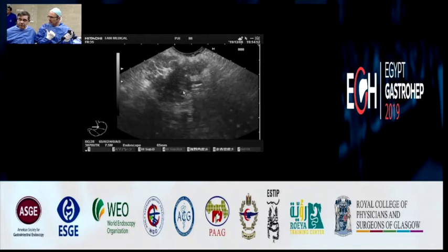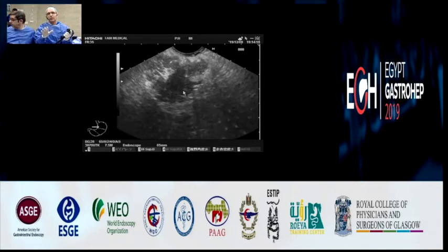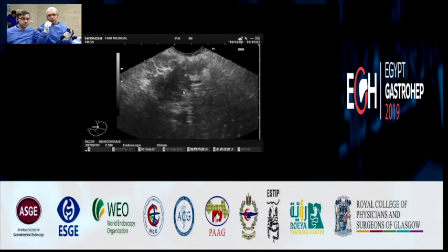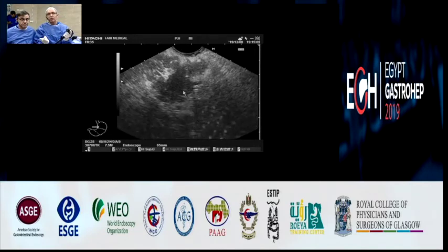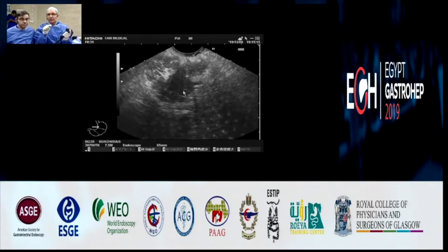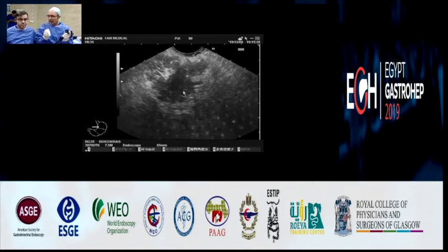Do you agree? Fully agree. We need histology, the architecture of the lesion. So this is very important. There is a study from Japan using FNA showing that you could make a definitive diagnosis in only 20% of the cases, very low. But the same group did a multi-center study in Japan, and using FNB, they could reach a good diagnosis in 70%, much better. So that's why you're going to choose a core needle biopsy.